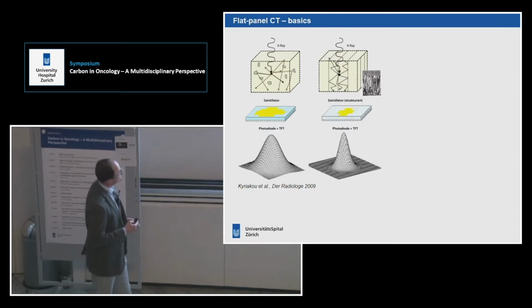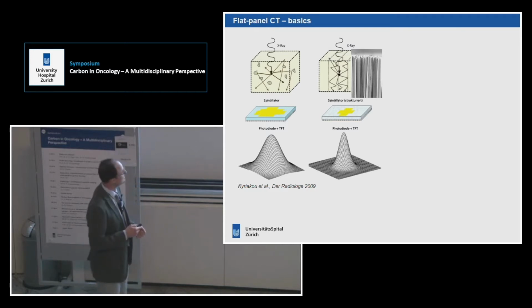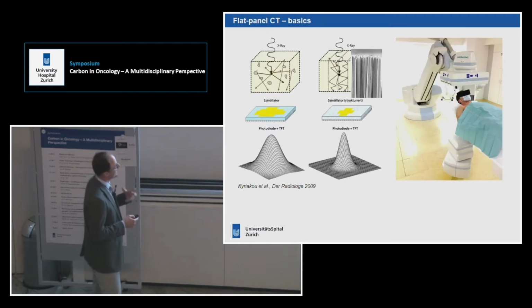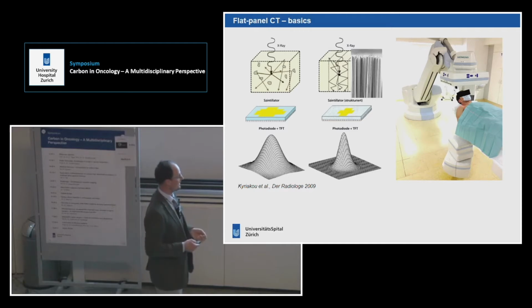There's also another concept that maybe surgeons deal with. It's the flat panel CT. It's actually using detectors with highly oriented scintillator crystals, making high resolution images, and those detectors are usually mounted like flat panels on those C-arms that can rotate patients in any arbitrary direction.